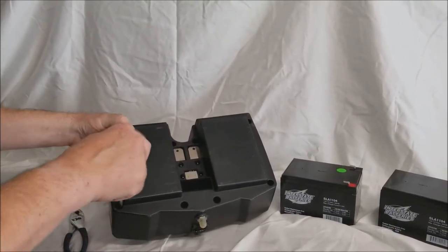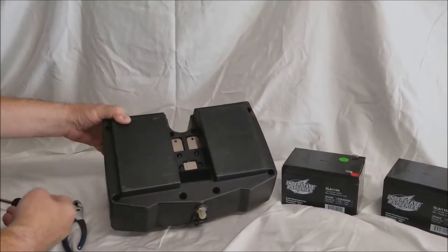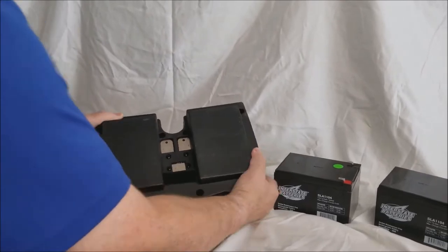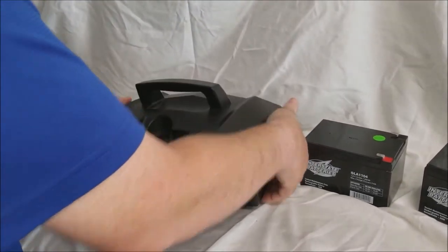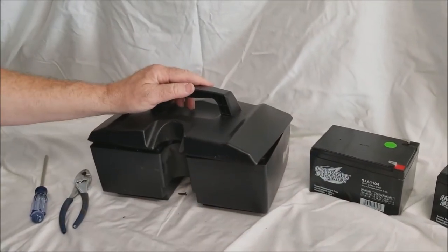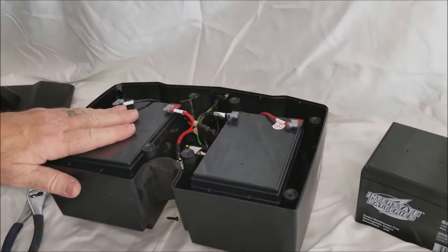So I'm just removing the last screw here. I've loosened up all the other ones. And now I'm going to turn this over. You want to turn it over so that the screws fall on the table rather than on the floor. We're going to lift the top off. And here we see the batteries.